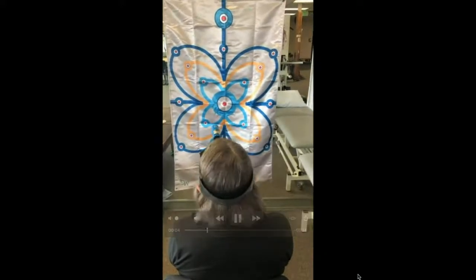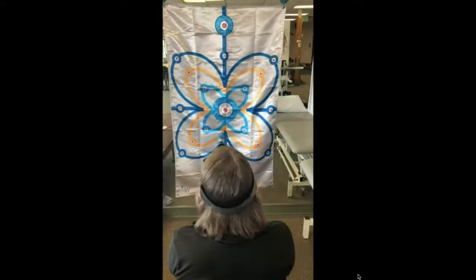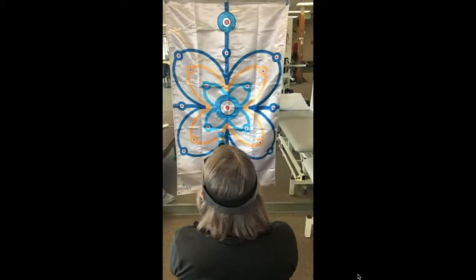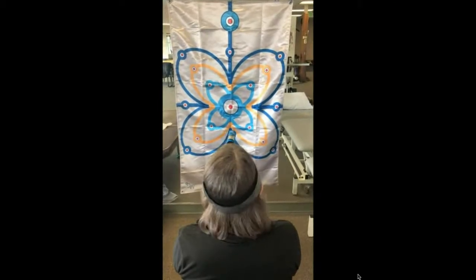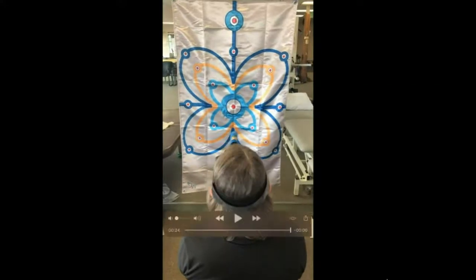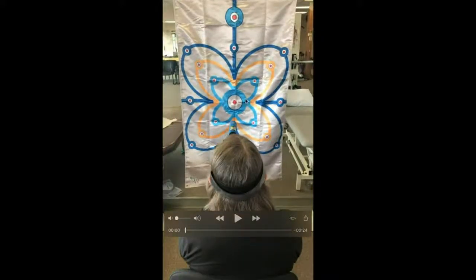And so just the general cue is shaking her head no back and forth. And again, a normal test would be about 1 hertz back and forth. And we can just video and watch what happens with the laser. And so again, she's not looking at that top red target. She's looking at the center red target. But I want the laser to give me a representation of what's going on, but I don't want it to be distracting for her. So I'm not putting the laser in the middle of the line of the target. I'm putting the laser above so that she can't see it as well, maybe a little bit out of her peripheral vision. But let's break down what's going on here.